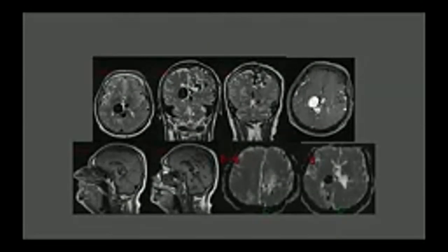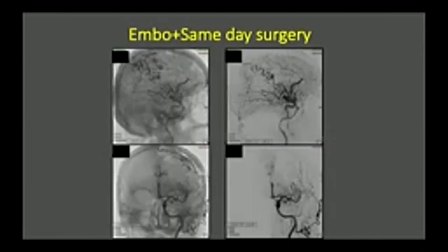By doing so, you really reach fantastic images like this case. Unruptured, but a very huge AVM, grade 5, symptoms coming from the venous side with an aneurysm. And you can do whatever you want, a double catheter technique, pressure technique, or transvenous, and you are able to reach that occlusion. It is for us a piece of cake to occlude that part, but we left this part just to prevent early venous thrombosis. And then sent the patient to open surgery, and they took it out.